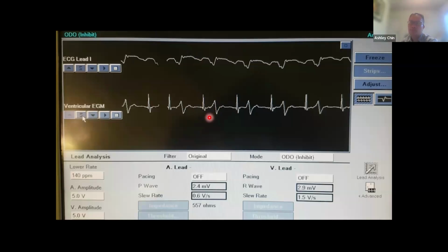I do know some individuals that don't use signals, and you can probe with just the decapolar catheter. Which you can do, but I find if you've got the signals, it just gives you free added information to get into there.